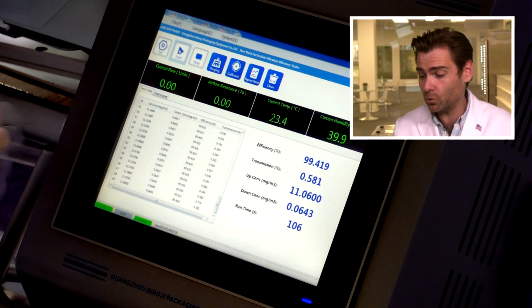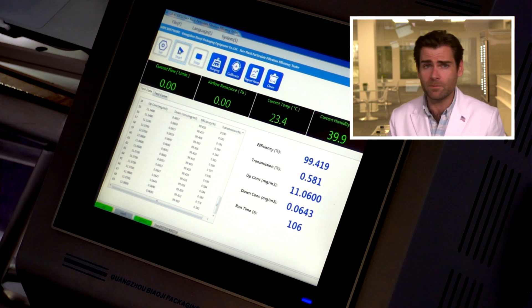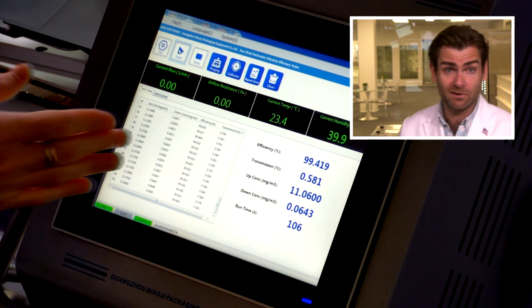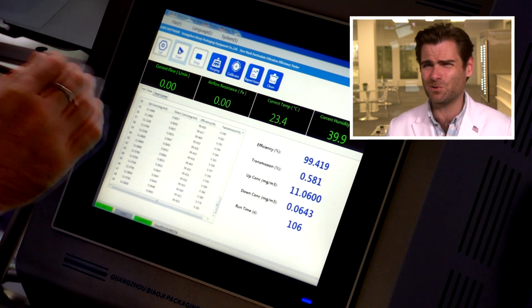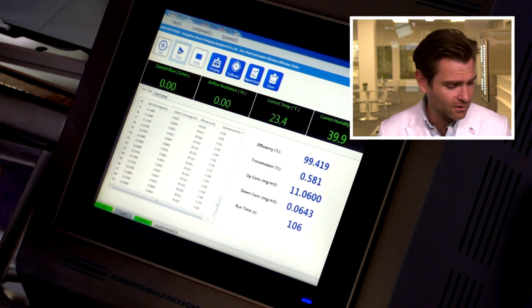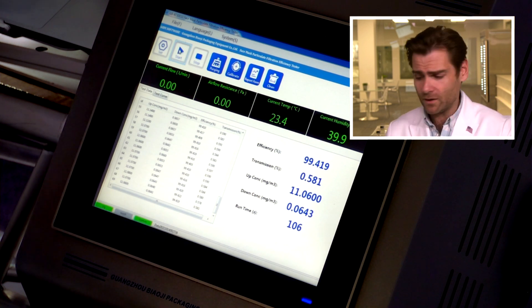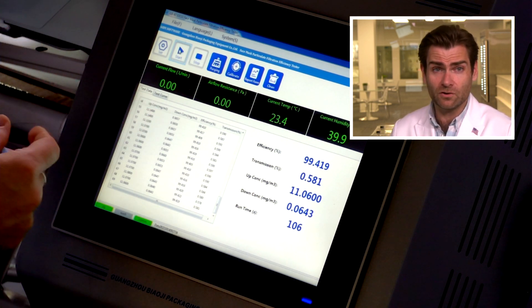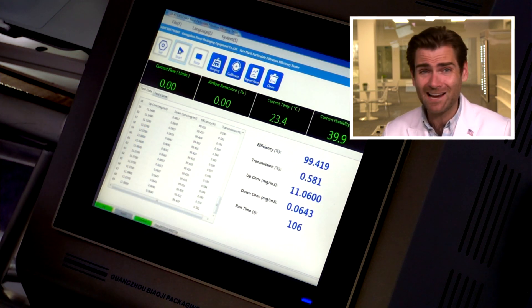If you saw that real quick — 133 pascals. Normally that would be great. Our cup respirator when we put it in here is right around 150, or actually I think it's 200. Our surgical N95 mask is right around this, so it's very similar. And look at that filtration efficiency: 99.419%. 99.419%.